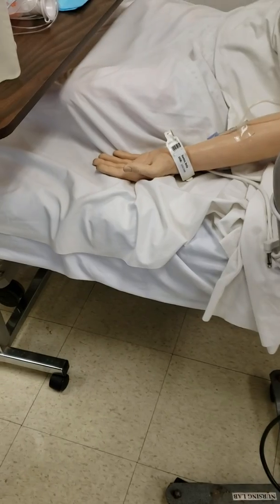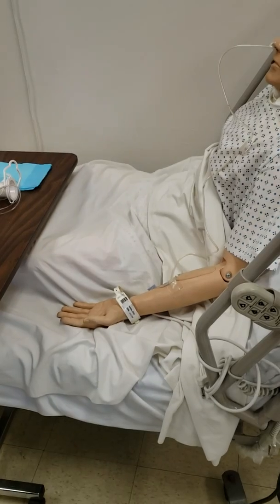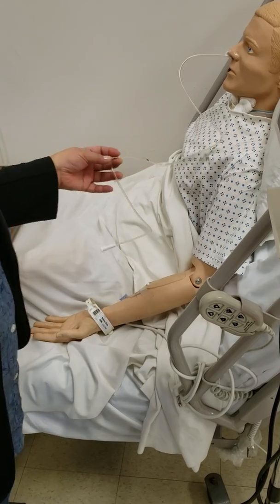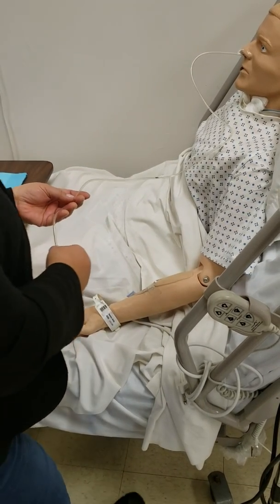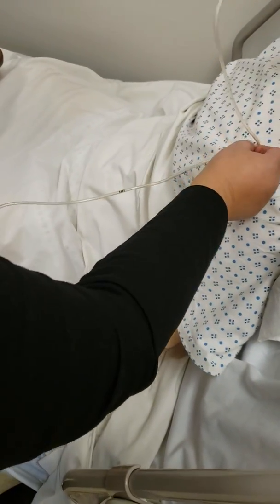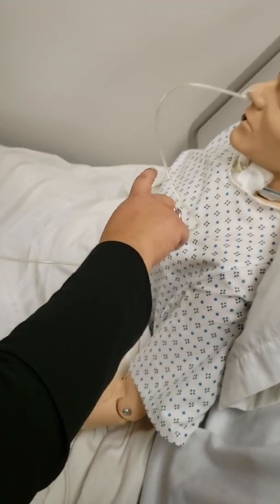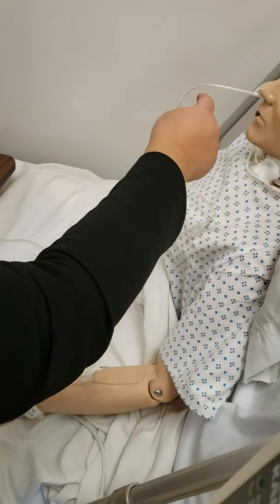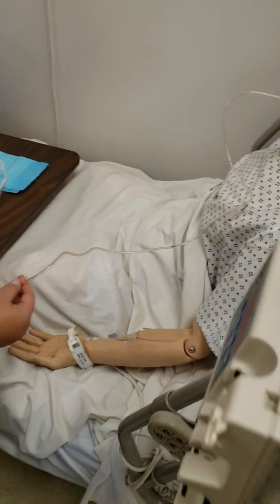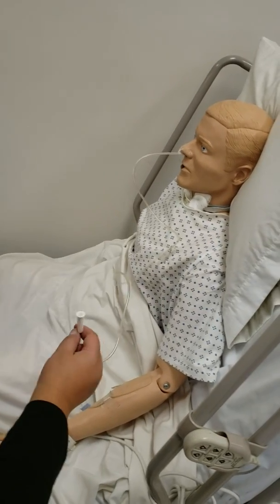And what we're gonna do with the patient, we will explain to the teacher how to check the length of the NG tube. All right. So you see the markers there? Usually it's indicated in the nurse's note how long it is, how far from the tip of the nose to here. Usually the nurse documents it.